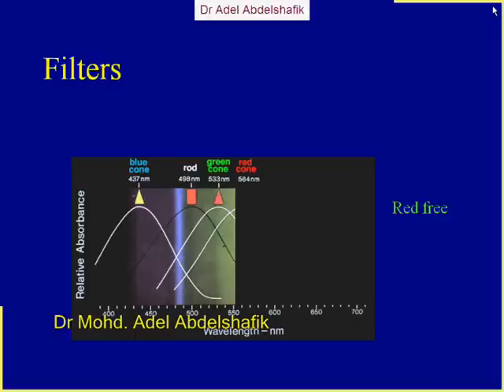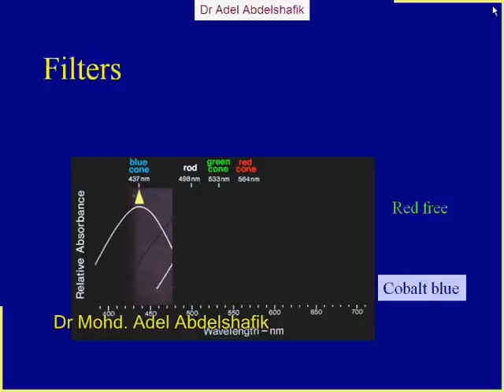If you get the long waves, they can pass into the tissue and still they get the energy to keep on, while the short waves pass a short period, then there is no energy, they cannot penetrate anymore. And this is the idea of using a short wave to see superficial structures. So the retina, if you want to see a lesion in the superficial nerve fiber layers, in the retinal nerve fiber layers, then you use the red free light. It will not penetrate to the choroid. It will still be in the superficial part of the retina.